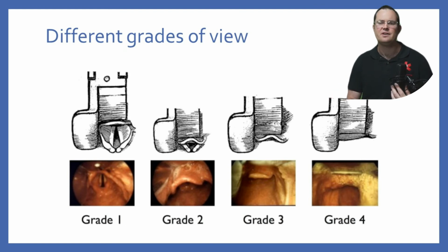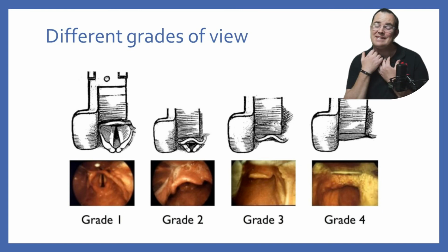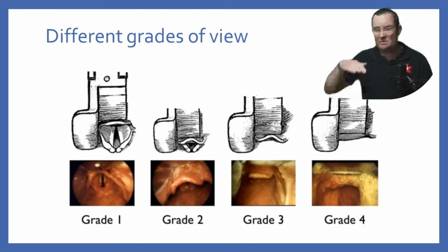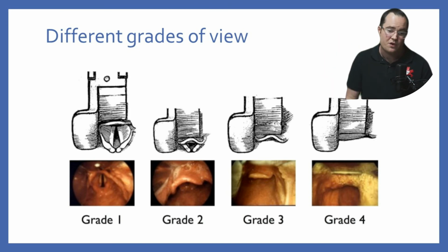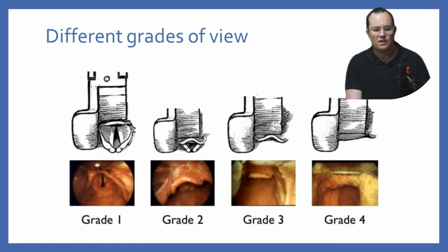Mike brings up the bougie. Not a bad idea, especially once you start getting some interesting looking damage or swelling occurring inside the oropharynx. It's not a bad idea to use a bougie. The problem with the bougie is sometimes it's very flimsy. If you had a grade 3 or grade 4 view, good luck trying to fish that thing around and trying to figure out where it's headed. You need to use better tools to get in there. And I hope these views helped you understand that.